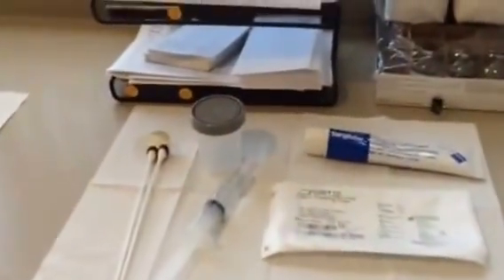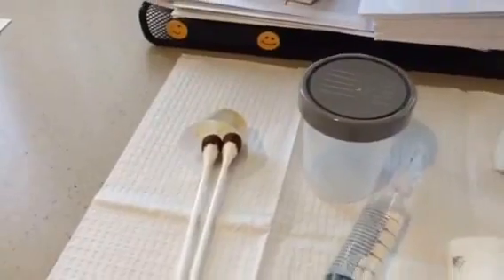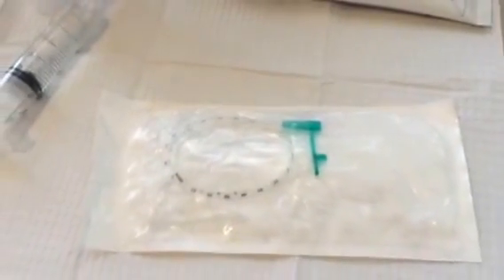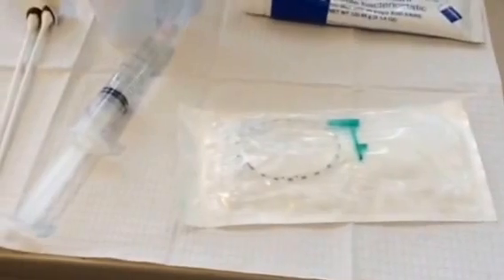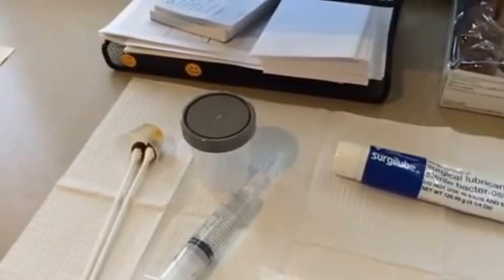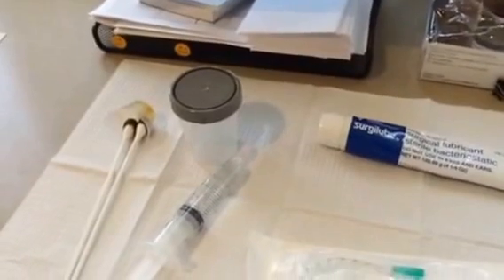We wipe the urethra with a little bit of iodine on some swabs. We have a urine cup. We usually use 8 French pediatric feeding tubes — you can see the label here. We apply a little bit of sterile lubricant on the tip of the catheter when it's inserted into the urethra. We put the residual urine into the cup and test it for possible infection or blood.